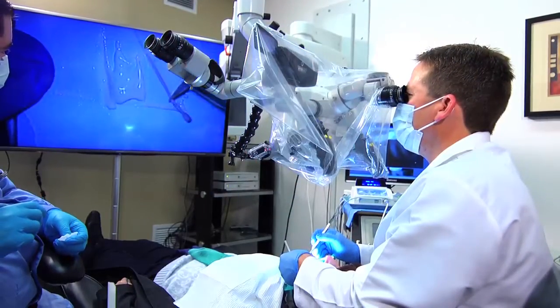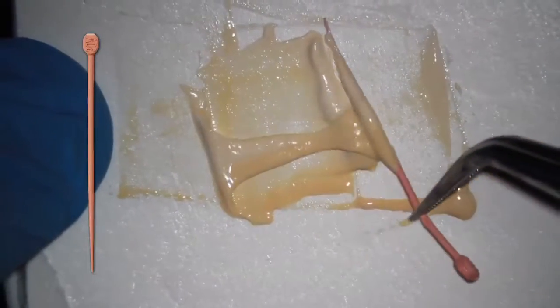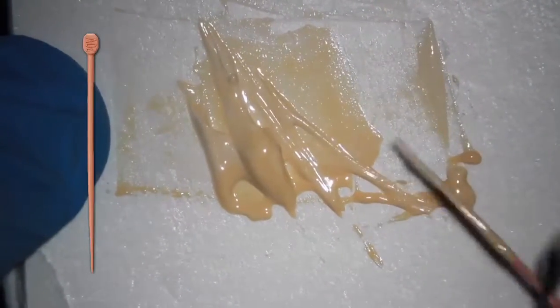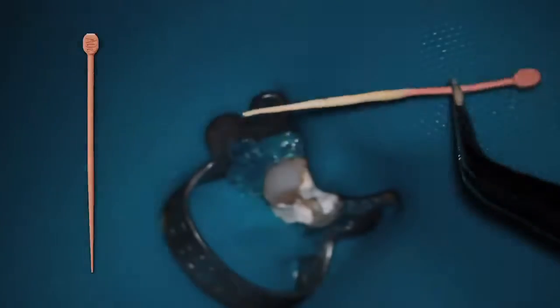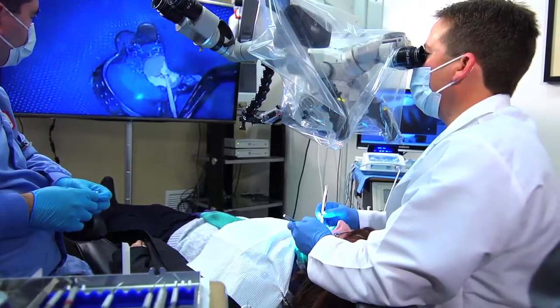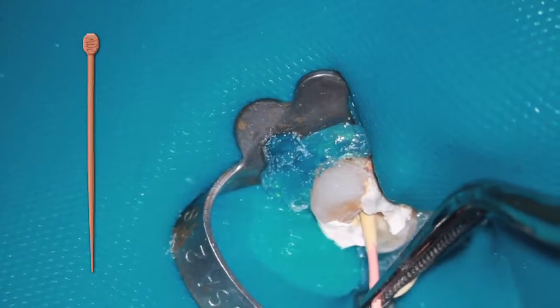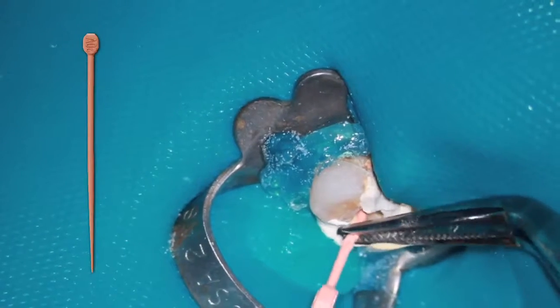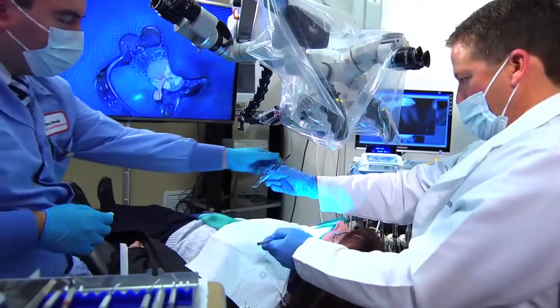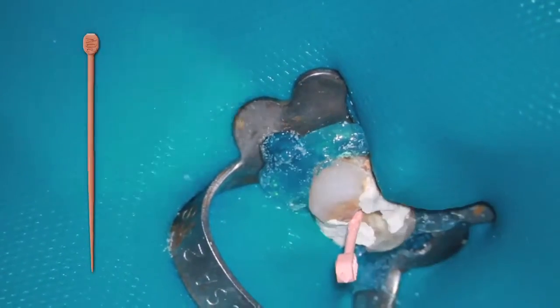Now I'm going to take the gutta percha cone, and it's just like butter on corn. I'm going to push through to make sure that my mix is complete. And then I'm going to pull and gently remove any excess. I'm going to take my cone, I'm going to place it into my canal, 2/3 of the way, pull it back up, then run it back through. That recoats my tip gently, so now I can send it right there. Now I have a great stop apically from the placement. Now, as you can see, I'm placed in my canal system with my master cone with sealer.